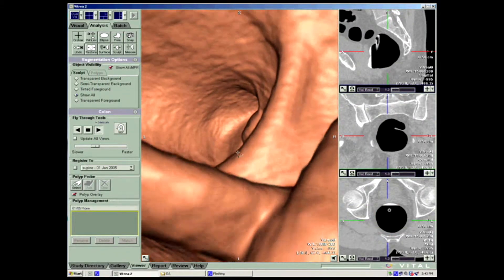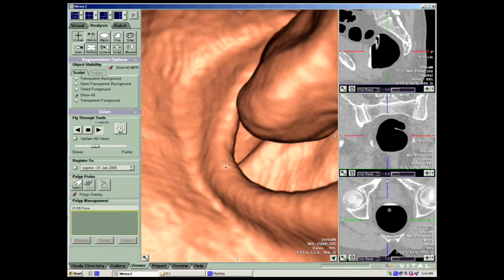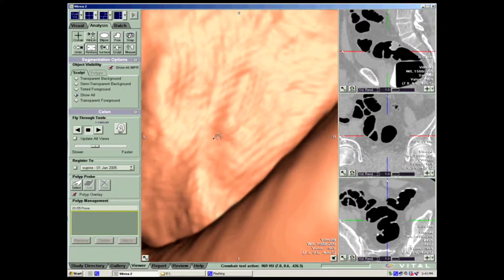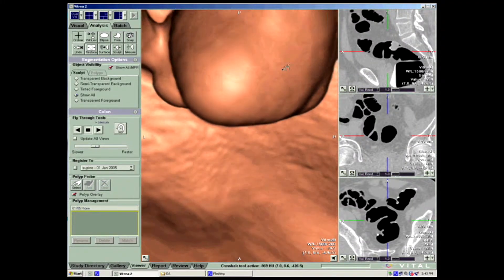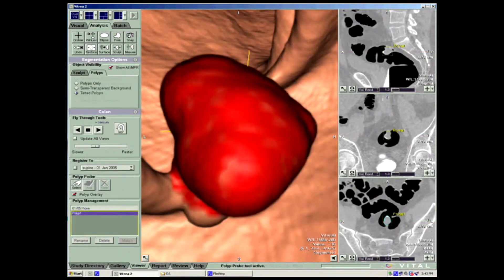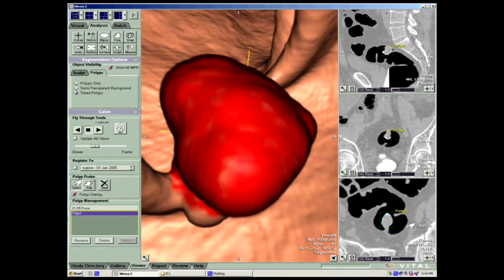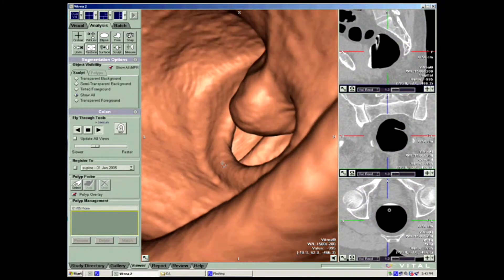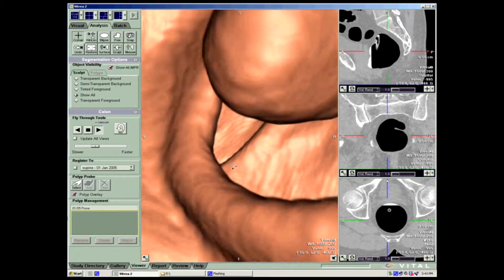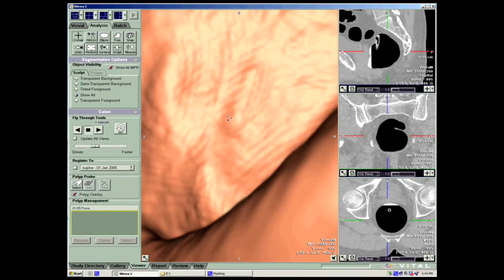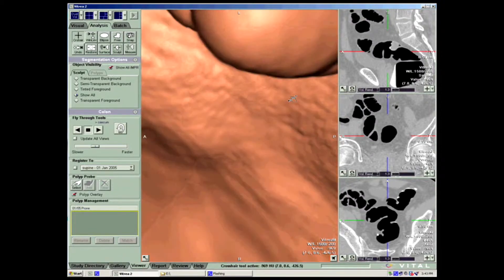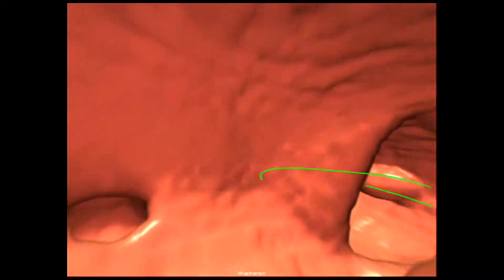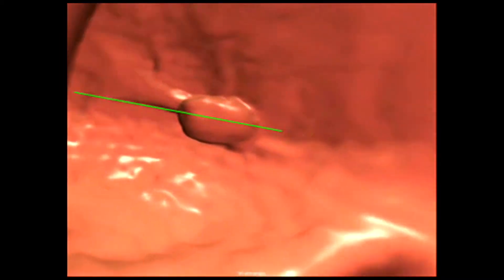Here's a patient where we just passed the rectal tube. There's a large pedunculated polyp. A lot of the software has currently progressed to the point where it decreases your interpretation time. This has the option of automatically measuring the maximum diameter as well as the maximum volume, and determining distance from the anorectal junction. All of that is easily imported into the report. The green line is actually the center line generated by the computer algorithm.